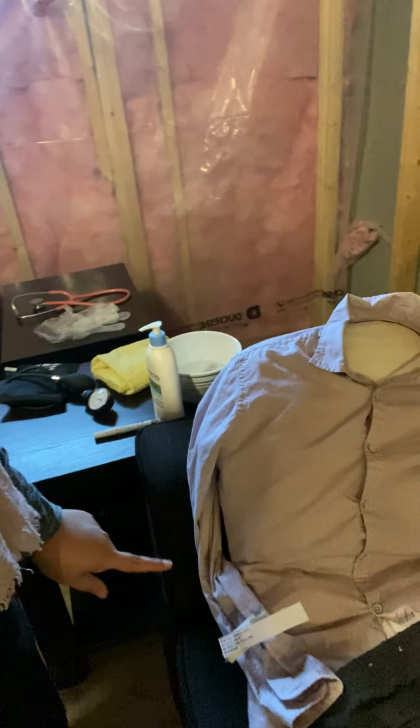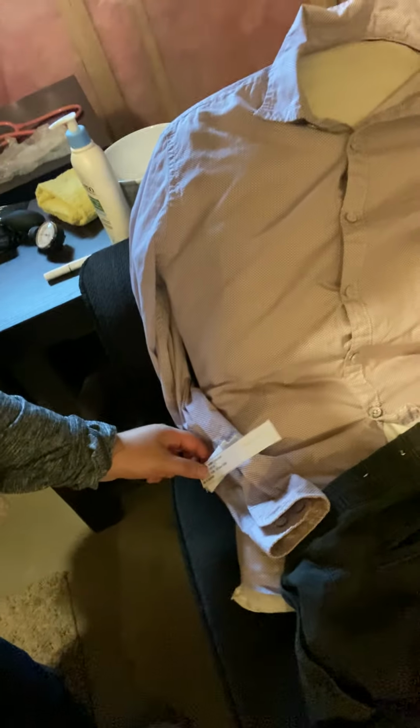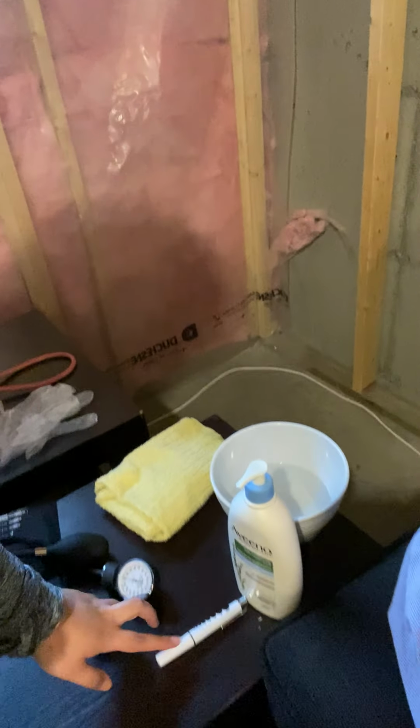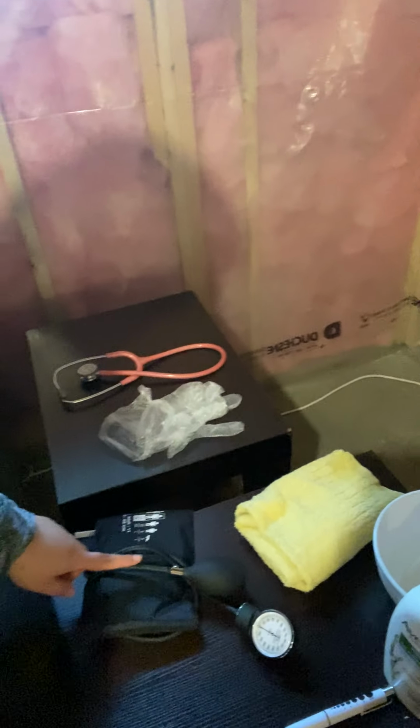And this is my patient's room. This is my patient with his left forearm, where I'm going to be applying one of the medications. And this is my patient ID that I'm going to use to verify him. And this is all the supplies that I need. So a towel, water, hand hygiene, temperature and pen light, blood pressure cuff, gloves, and my stethoscope. So this is a view of what my patient room looks like and all the supplies that I need.